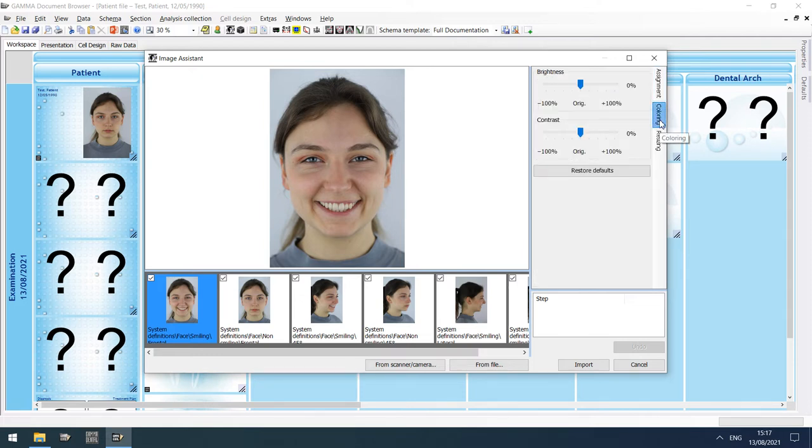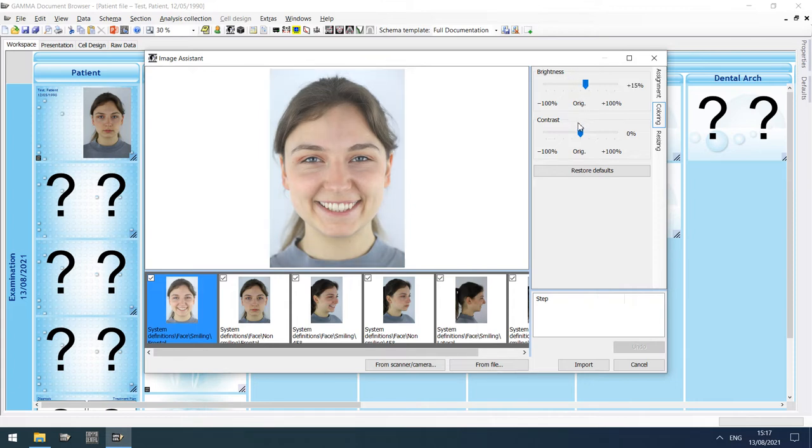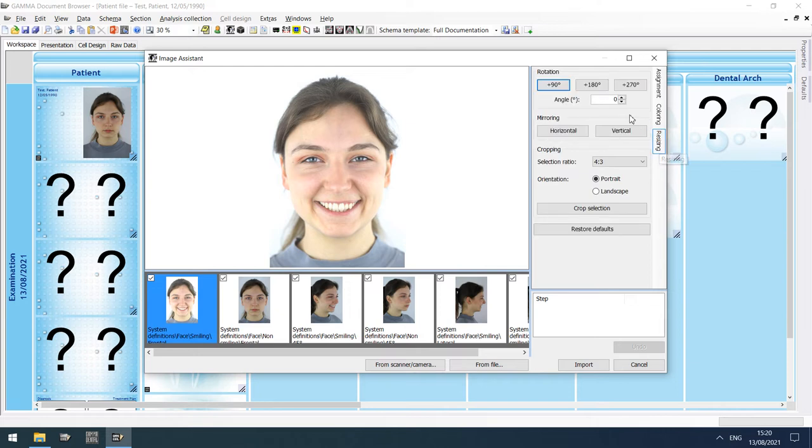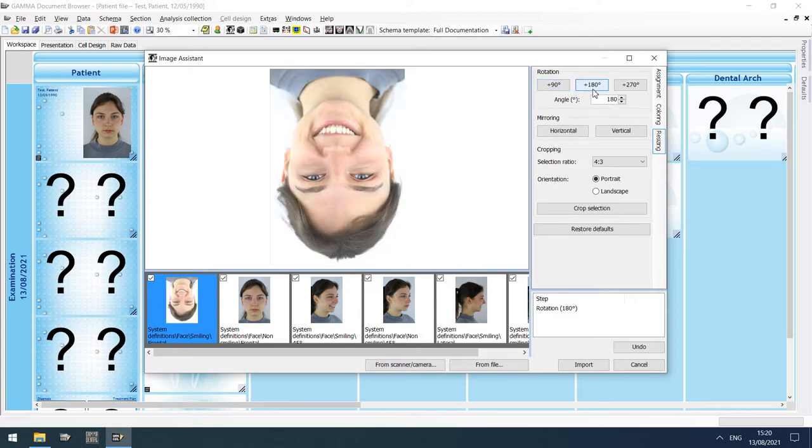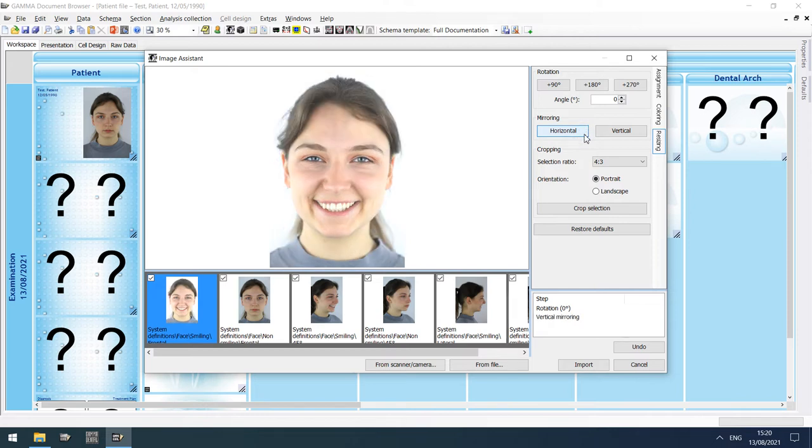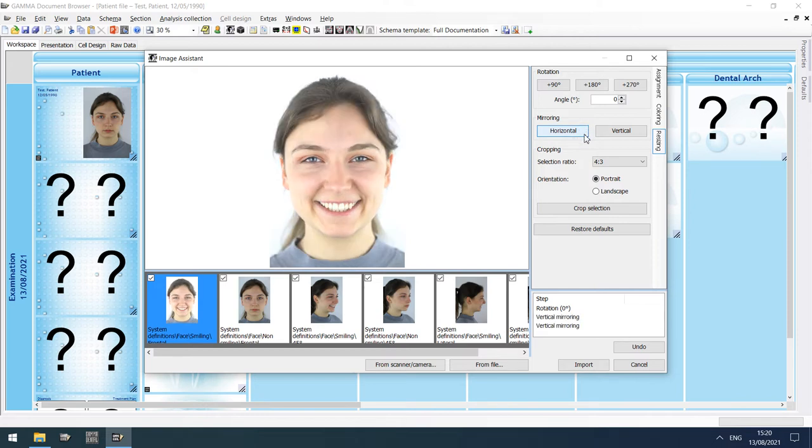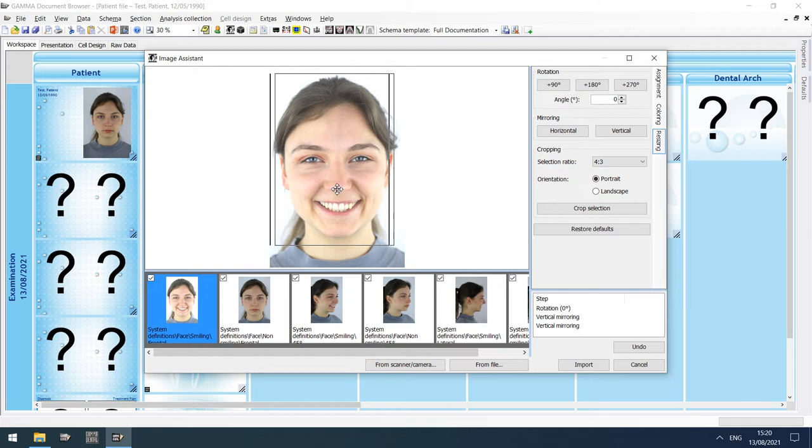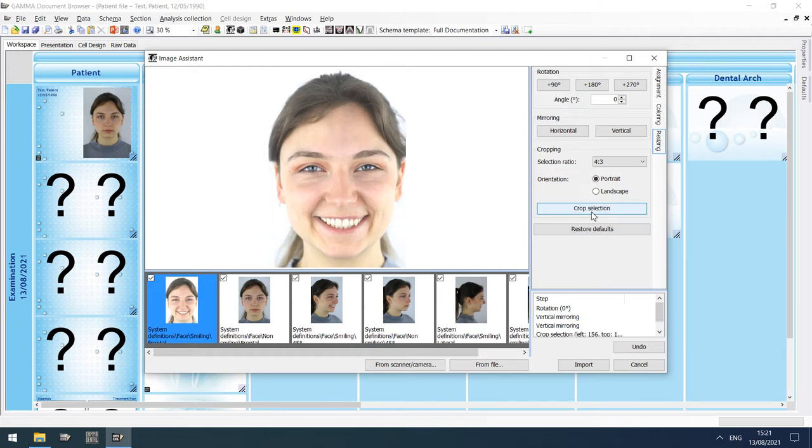For instance, on the coloring tool window, you can adjust the brightness and contrast of the selected image. On the resizing tool window, you can rotate the image, mirror it, or crop it while keeping a specified aspect ratio. In either case, you can restore the original image by pressing Restore defaults.